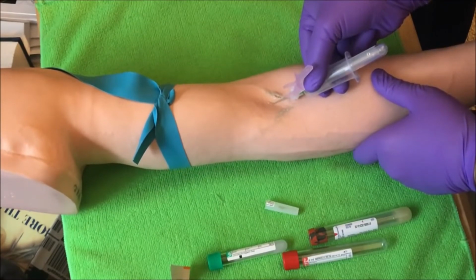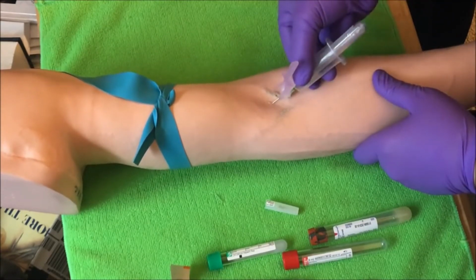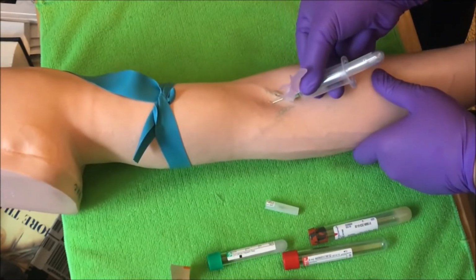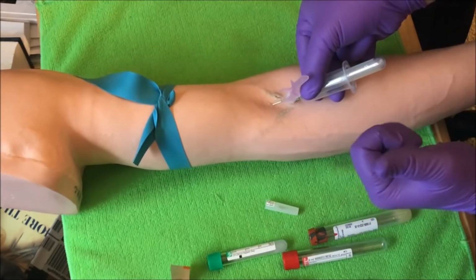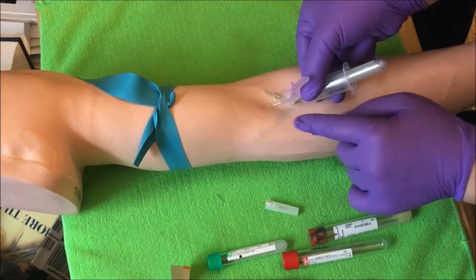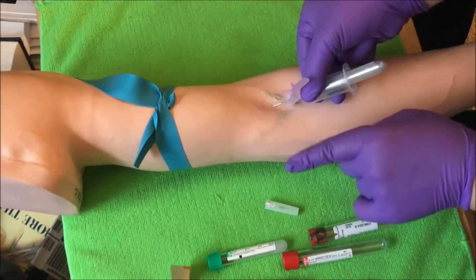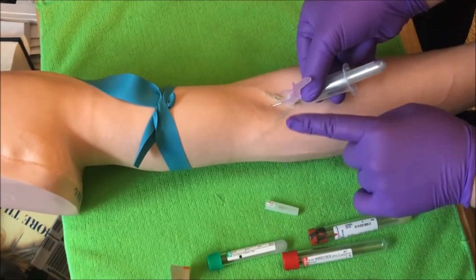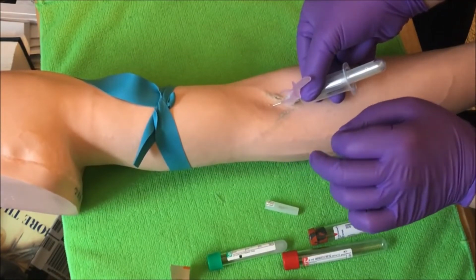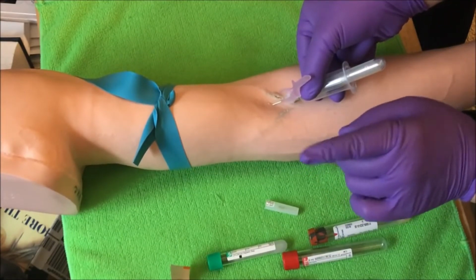I cannot, and this is against CLSI standards and against patient care, and this can cause damage, redirect my needle. I can't fish, what they call fishing. Fishing can cause damage to the inside of the arm. That needle is like a miniature scalpel. As I'm moving it, it can cut the tissue, it can lacerate the vein. I could even hit an artery and lacerate an artery if I'm not careful. You should never fish in a patient's arm.